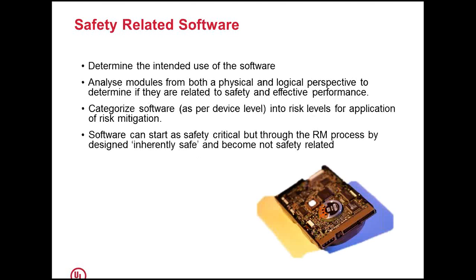Safety related software. So as I said earlier, software is an integral part of medical devices nowadays, where all the devices are controlled either by an embedded system or there is remote monitoring and diagnosis, where the data is communicated and viewed remotely as well.